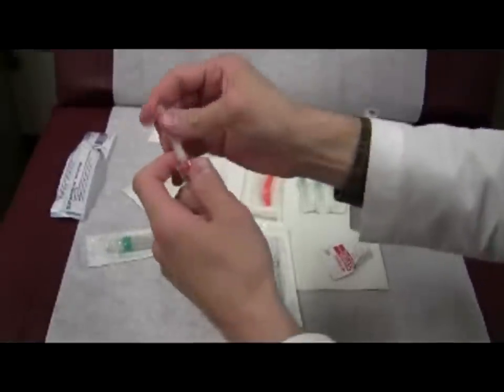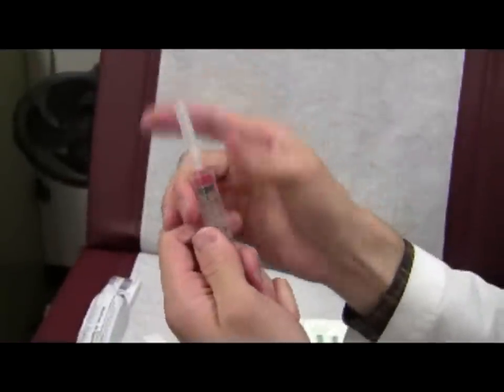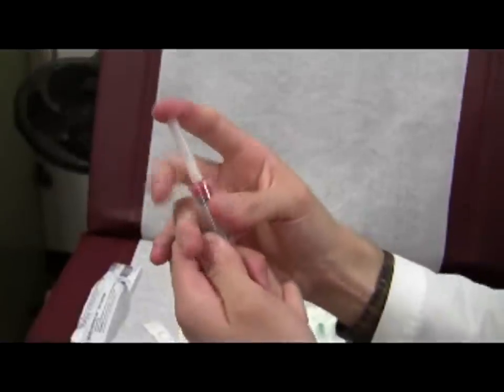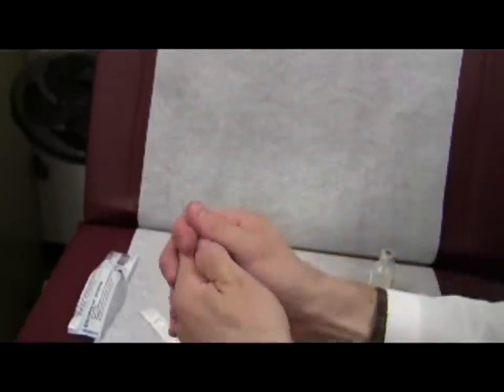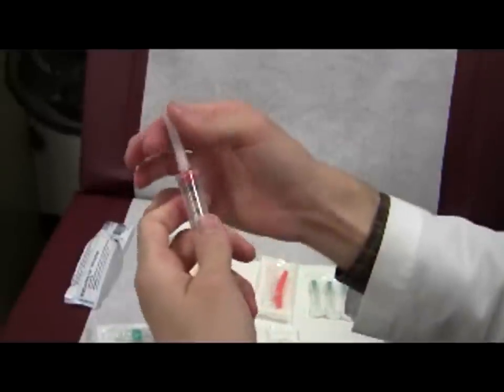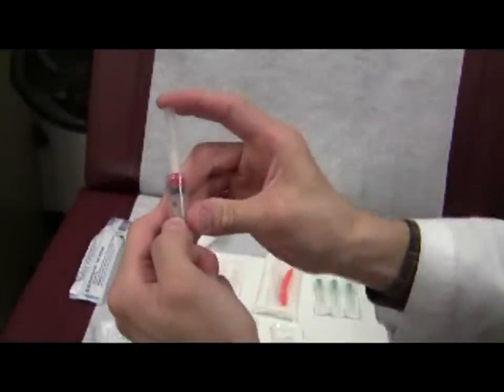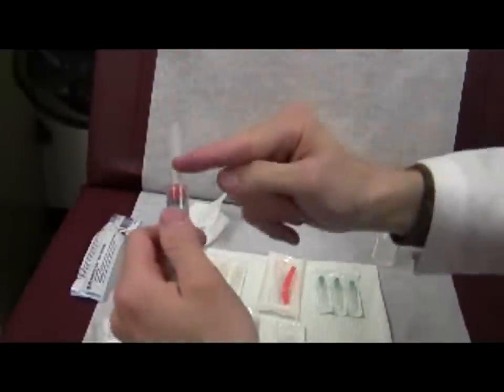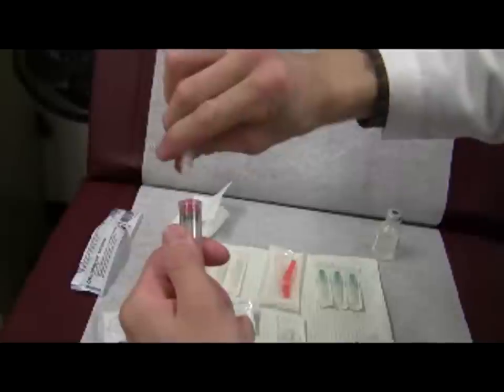But if you hear a snap, that means it's in, and now you can twist on and twist off. It's really more important that if this is loosely on and you try to twist it off, it doesn't twist well. You have to snap it, and then the cap is closer to the base of the needle and you have better torque, and it twists off.